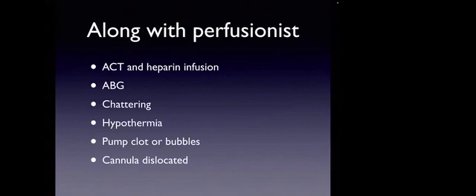There are certain aspects of ECMO care which are shared by the nurse along with the perfusionist. These are taking note of the ACT, the bedside ACT. Nowadays, we don't send APTTs very regularly because bedside ACTs are more common to monitor anticoagulation, and adjust the heparin infusion according to the ACT.